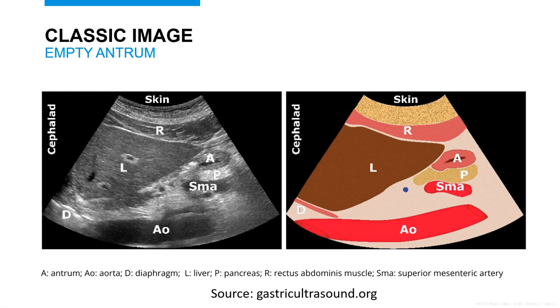Now that we have verified we're at the antrum, we can assess the appearance of the gastric antrum. Gastric ultrasound is first based off of qualitative assessment, so we're going to work on developing pattern recognition. Here we have an empty antrum — it is small, collapsed, and has the appearance of a bullseye. The bullseye pattern comes from the five alternating layers of the gastric wall.